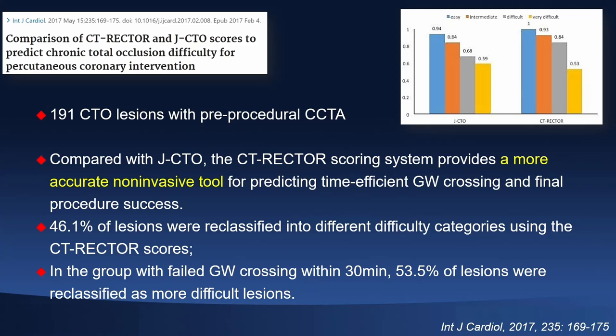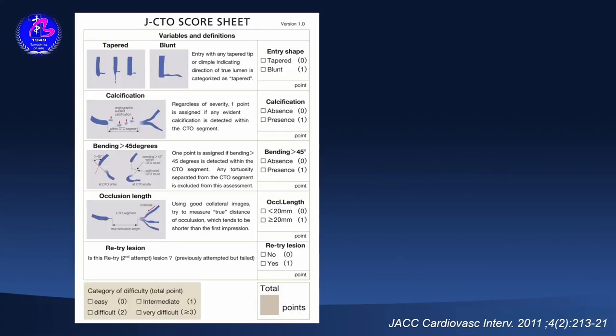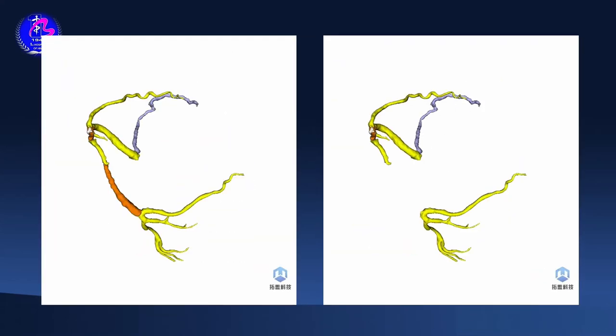So for this case, after we use the CT, especially the intelligent visualization system, we review the lesion distribution, so it should be a difficult one. Okay, another very interesting piece of information, so go to the previous slide, please. Previous one. Go on. Okay.